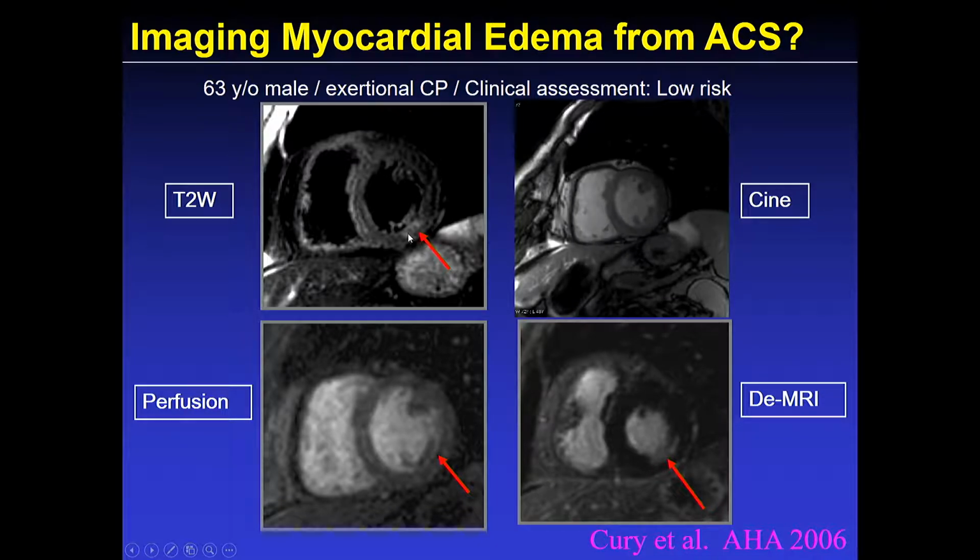So there's edema here indicating that there's an acute coronary syndrome. So the patient went to the cath lab and it was shown that there's an acute lesion in the circumflex artery. So by that, you can sort of lay out the different etiologies underlying myocardial changes.